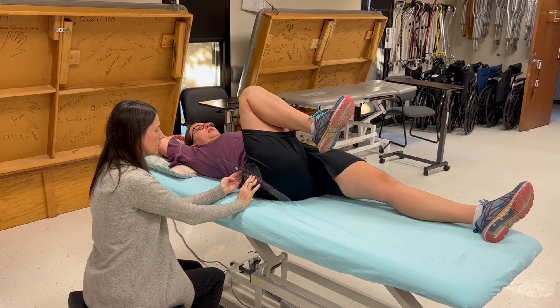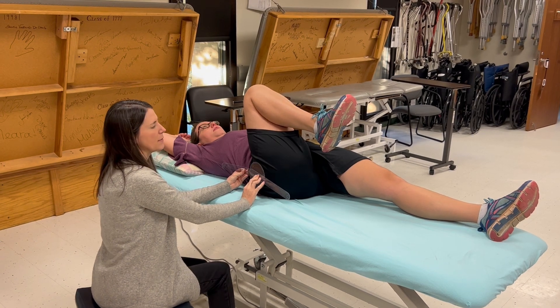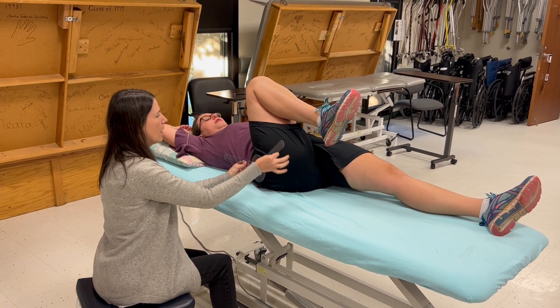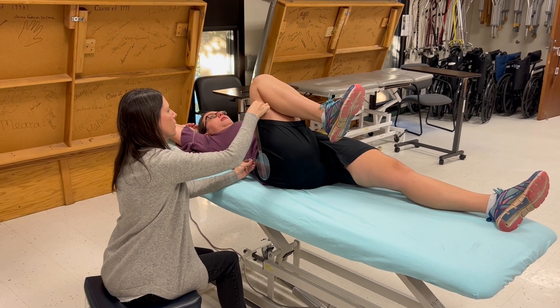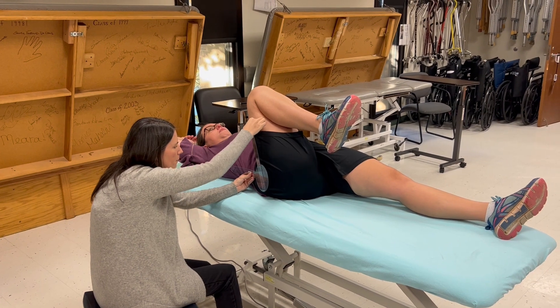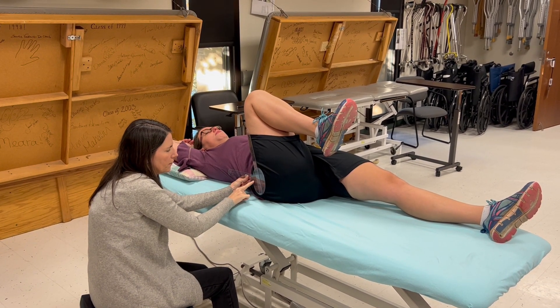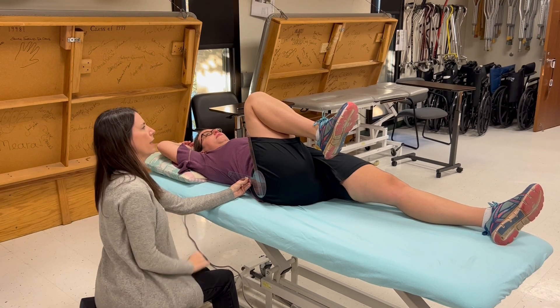The pelvis goes from greater trochanter to iliac crest, and I'm only looking at that component. Most of the time the stationary arm will be parallel with the bed. Then I come up to the lateral midline of the femur using the lateral condyle as my reference point. It started here and comes all the way out — so she's at 112 degrees of hip flexion.